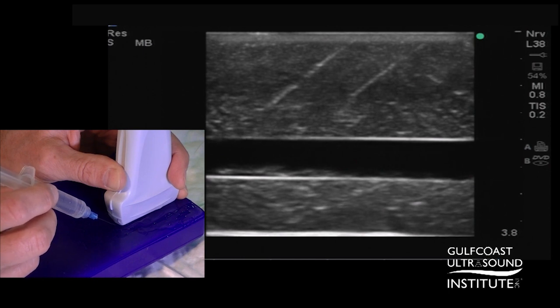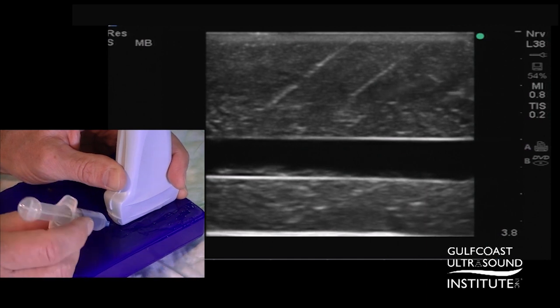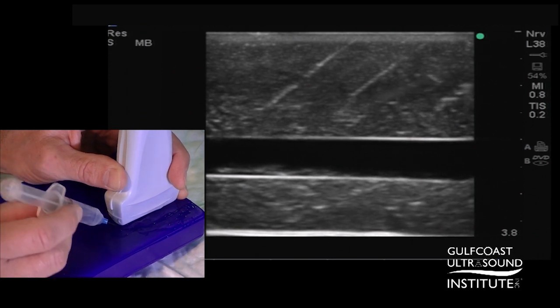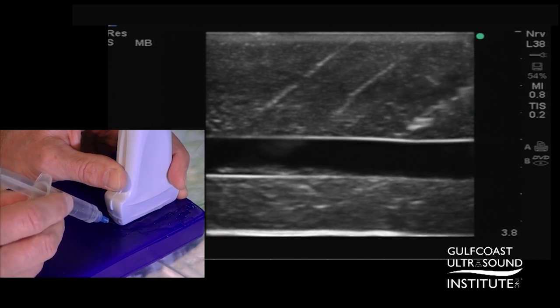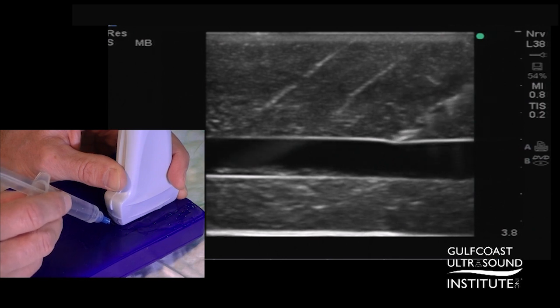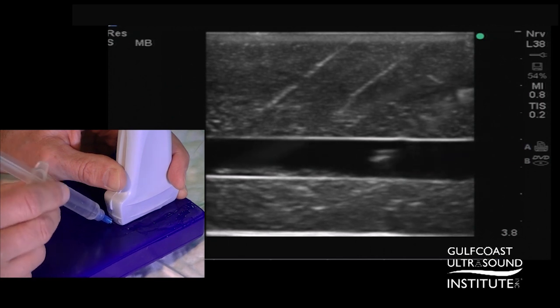We'll see the needle coming in from the side. Now we're at about a 45 degree angle on this one. As we advance, I move the needle tip side to side and you can see it appearing into the thin imaging sector of the probe. You can see it disappear, so we want to have it in the middle of the imaging sector before we advance again. I advance again, moving it side to side. I see the brightest point of the tip of the needle at that point. Now I will advance again into the target structure. I'm in the center of that target structure.